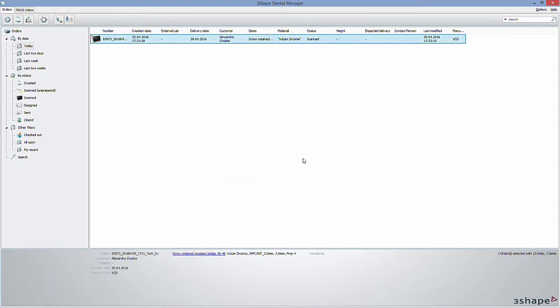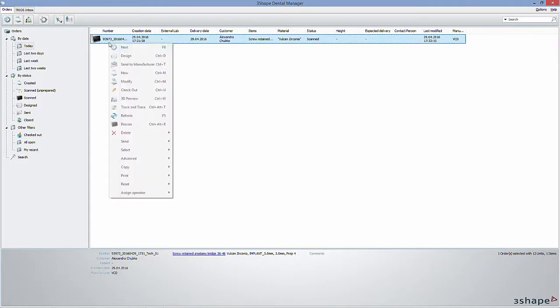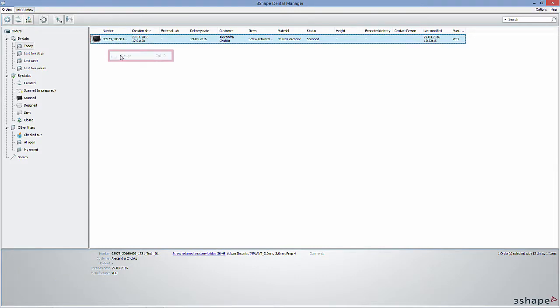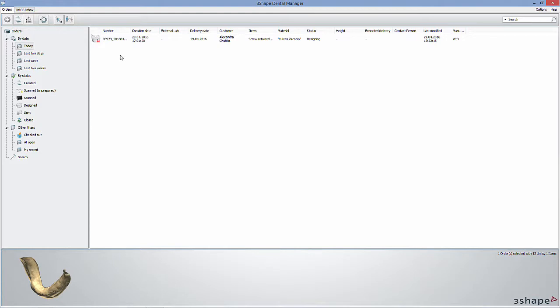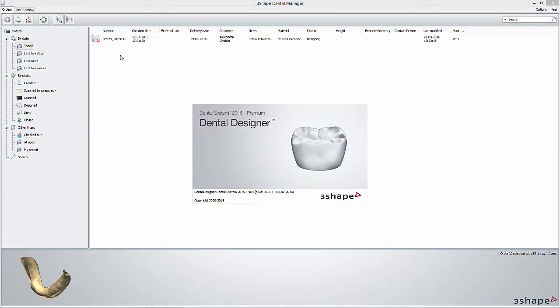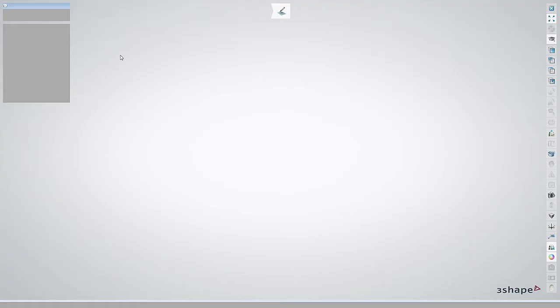Then you can right-click the order again and choose design or click next. You're now opening Dental Designer in Dental System. This is where you finish the prosthetics design.